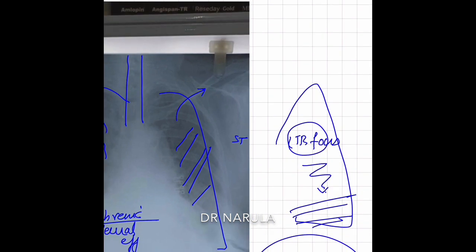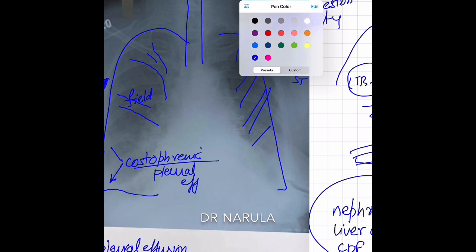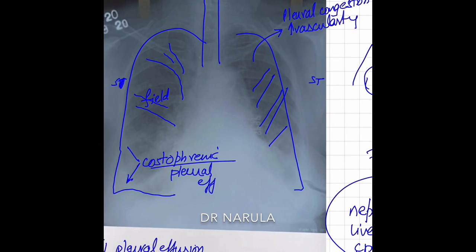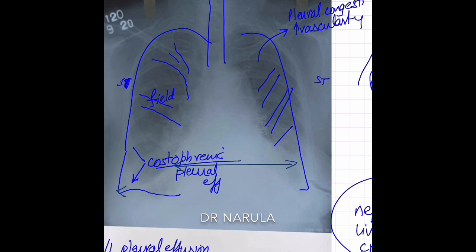This means there is increased vascularity — increased pulmonary congestion visible on the X-ray. We gather multiple clues from the X-ray to get a diagnosis. Now looking at the heart: the maximum length of the heart compared to the maximum length of the thorax — the cardiothoracic ratio — is more than 0.5, which means there is cardiomegaly.